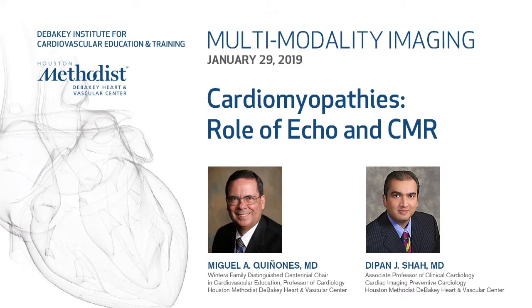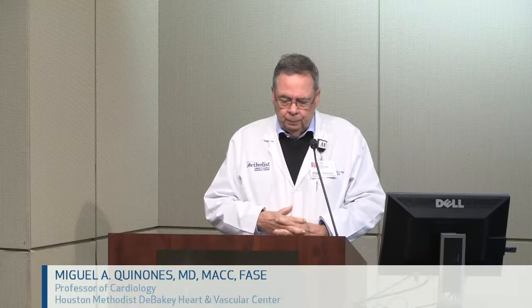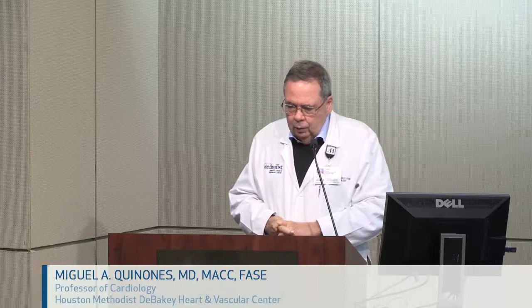So today's topic is cardiomyopathies, a very important topic. I would say every day in the echo lab, there are more than one or two cases that come through of some kind of cardiomyopathy. So by now, many of you are familiar with the topic and even with the imaging, but I think it's good to give an update and review it, and also hear some of the advancements that we're seeing with MRI.